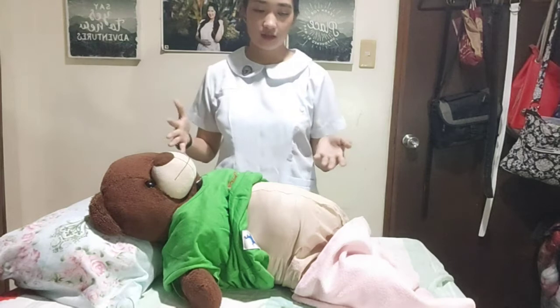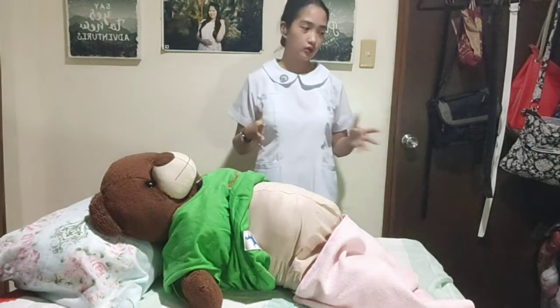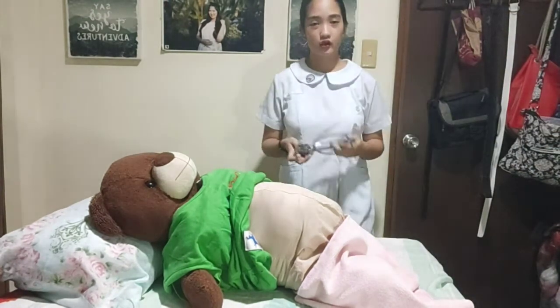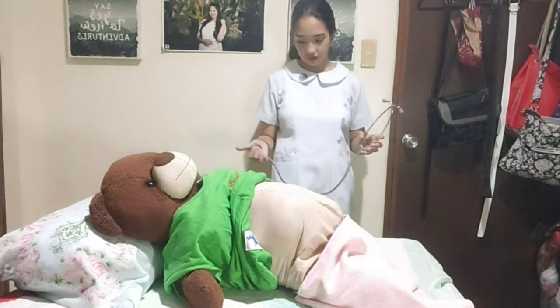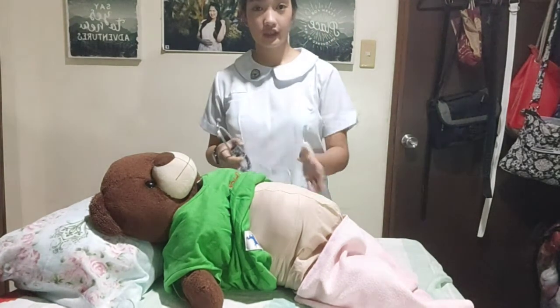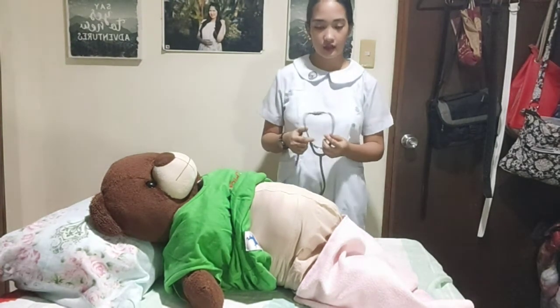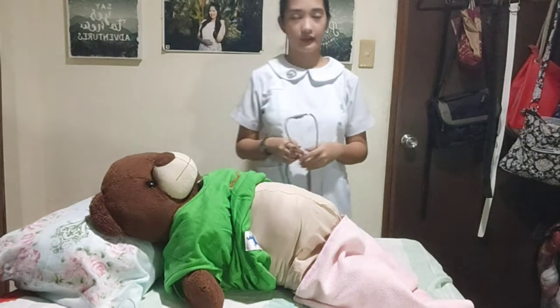So next, we need to auscultate the fetal heart tone. As we remember, the fetal heart tone is on the right lower quadrant of the mother's abdomen here. We will place the bell of our stethoscope on the area of the fetal back.